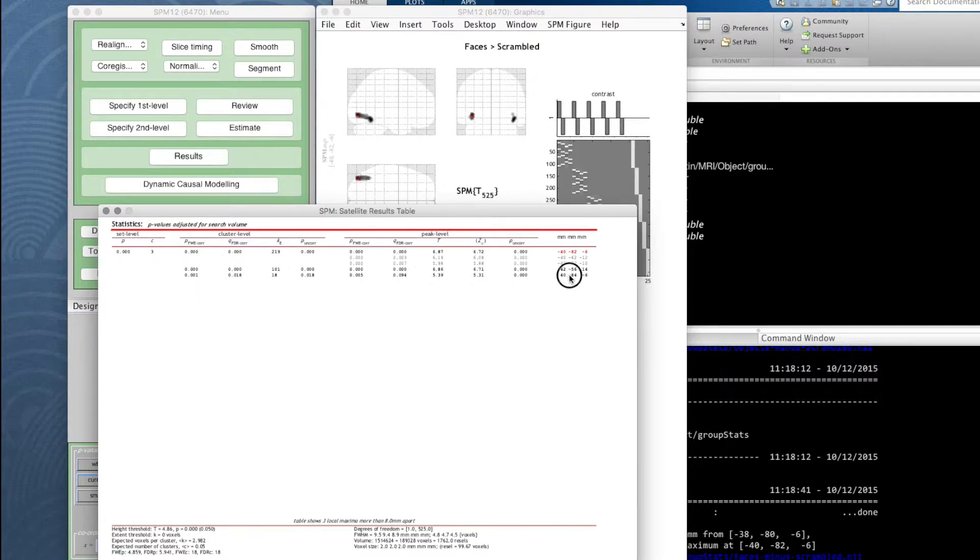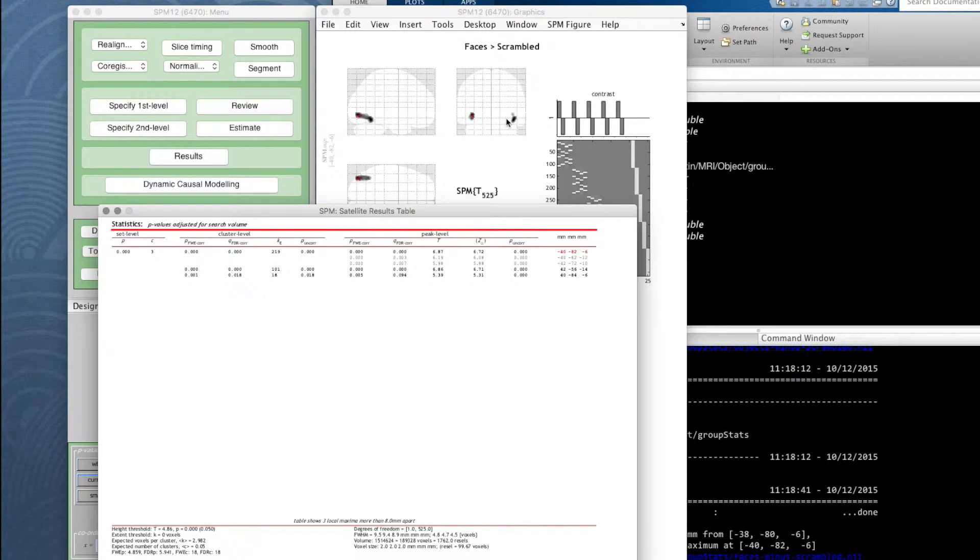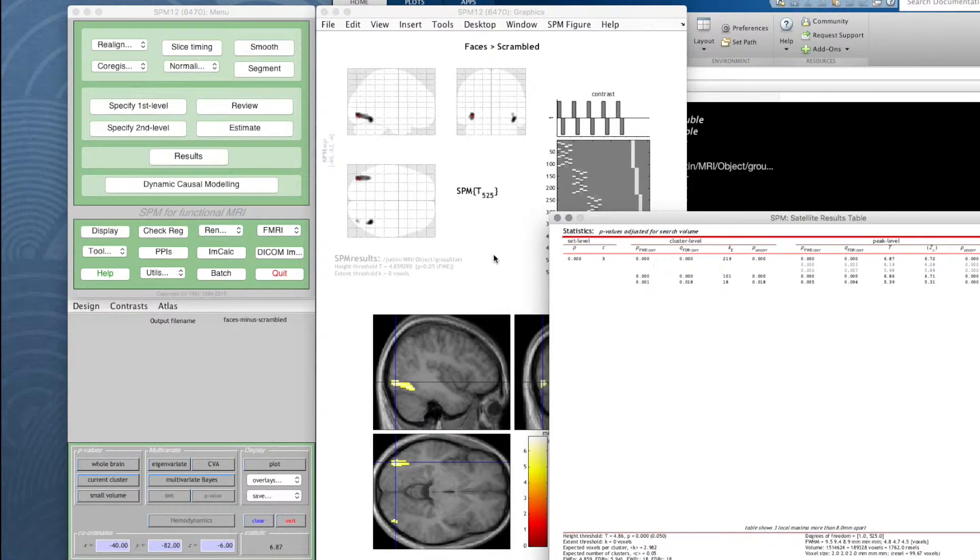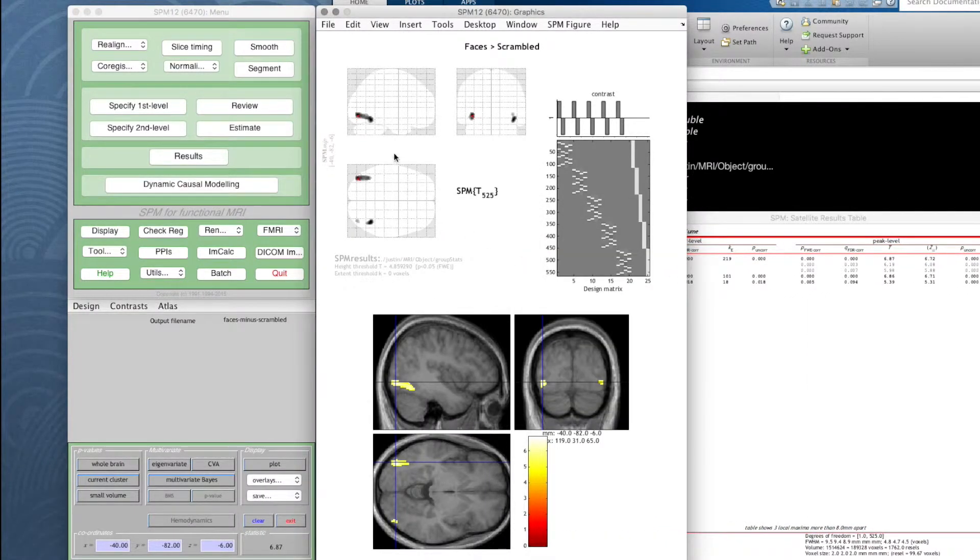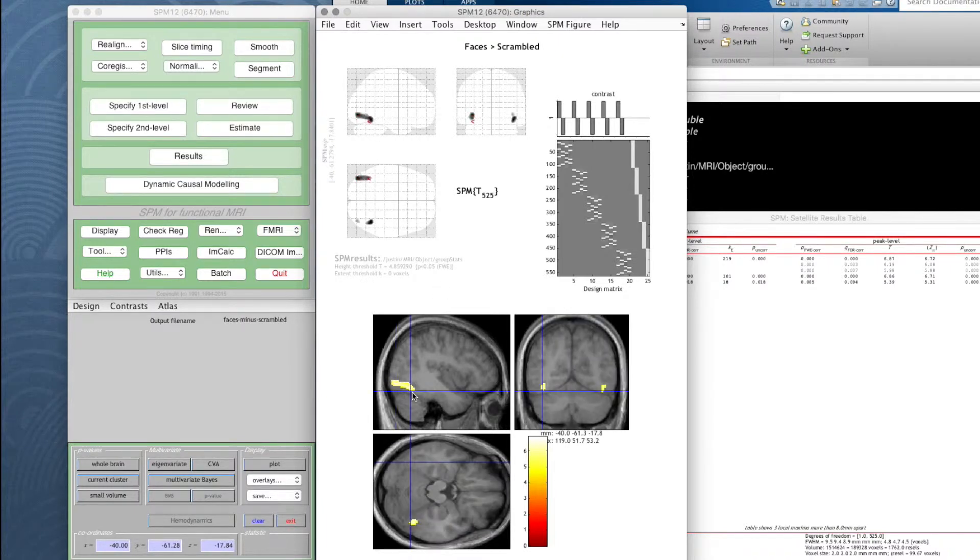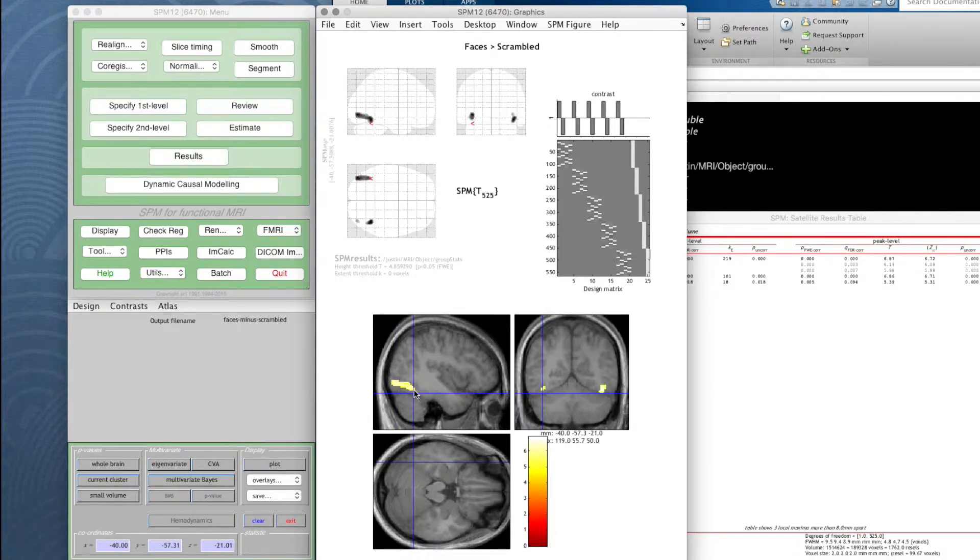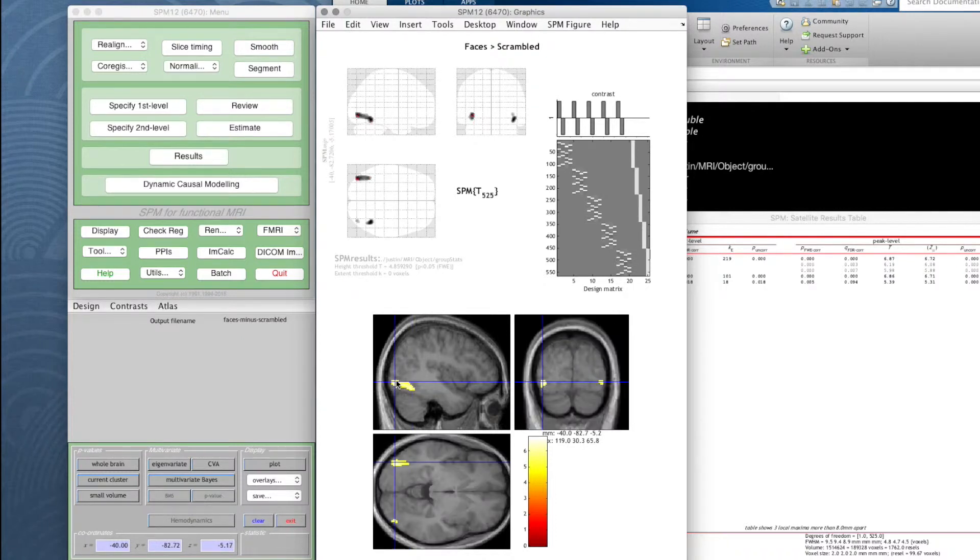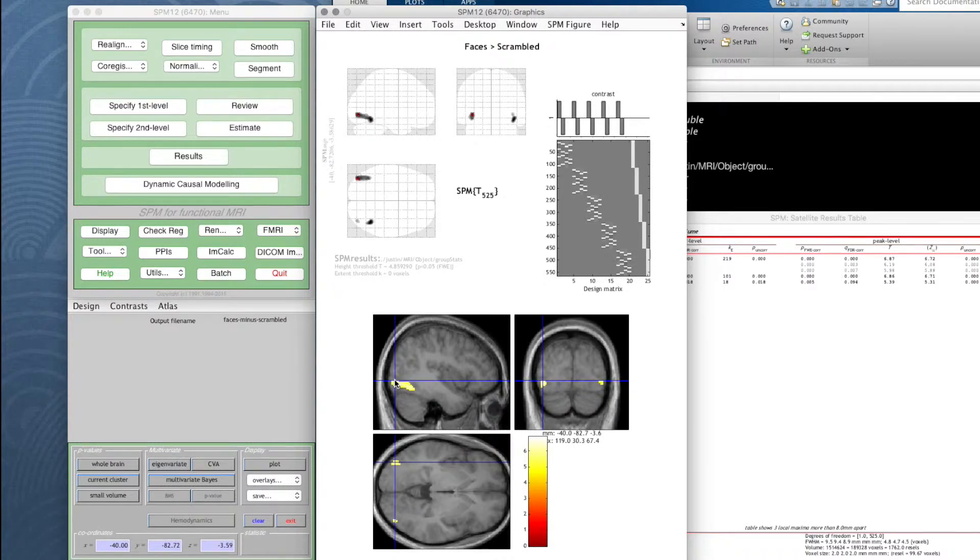We've got our x, y, and z coordinates. We've got foci at minus 40 and plus 40, that is left and right. It's important to get to know the coordinate system and know the extent of your activations going from about here, a z of minus 18 or so, up to a z of minus four or five here. This will come in useful in just a moment.